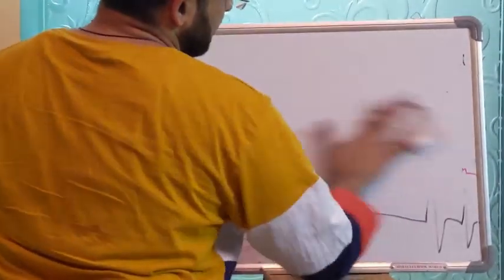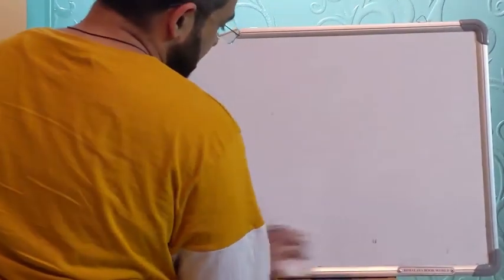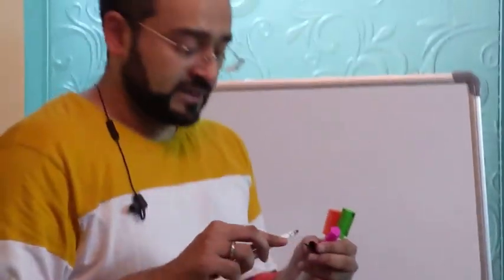Next, I will try to get you some ECGs. What I thought is I'll try to get some ECGs of sinus rhythm, of AF, of junctional rhythm, and I'll prepare a short presentation video in which I'll show these ECGs and then we'll discuss the ECGs.